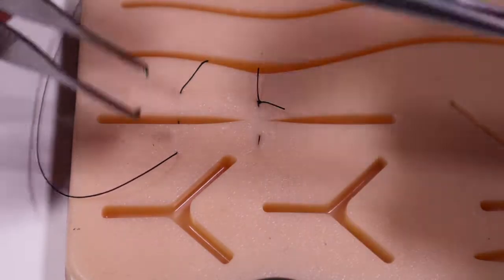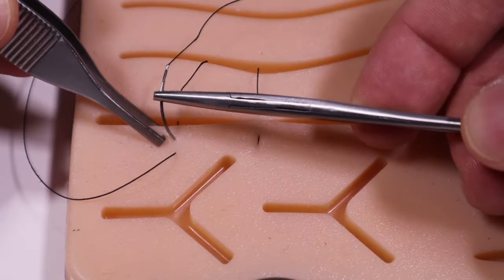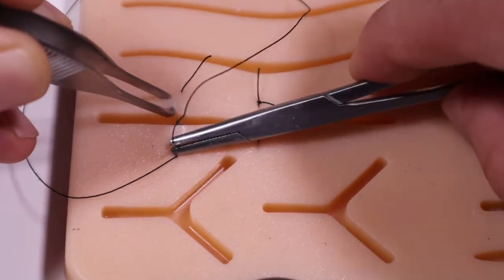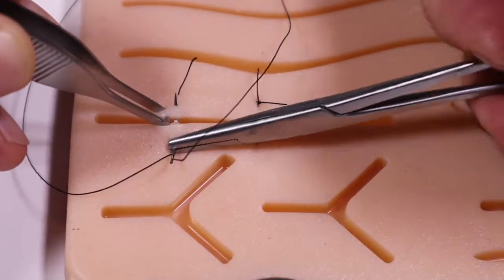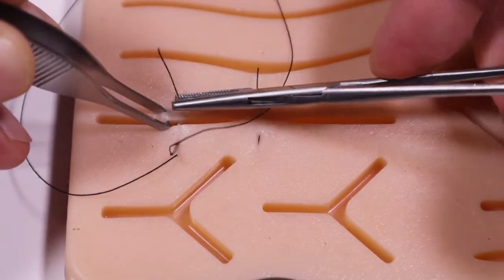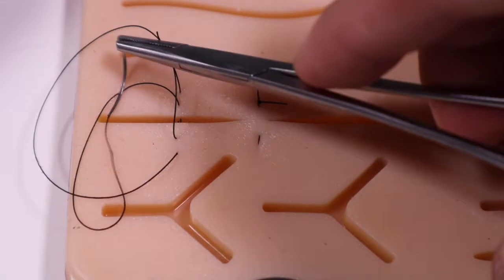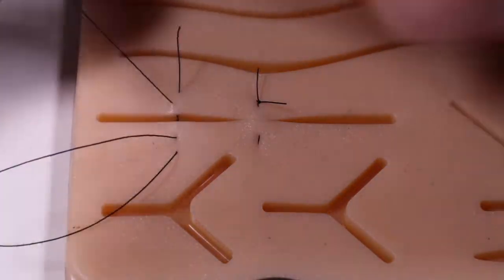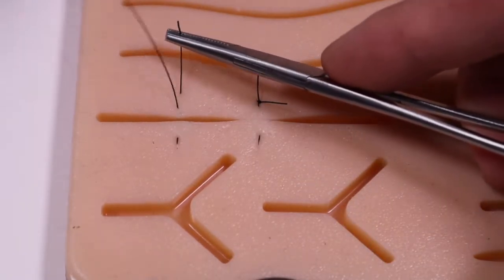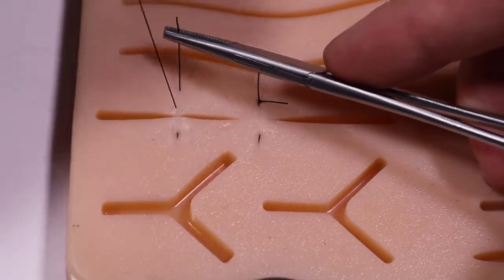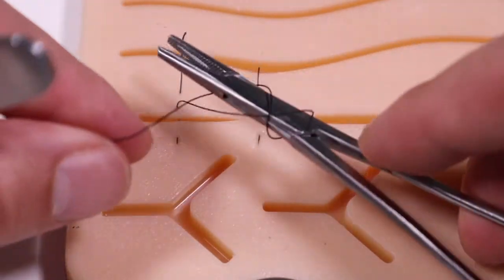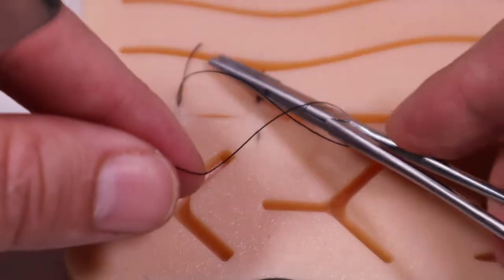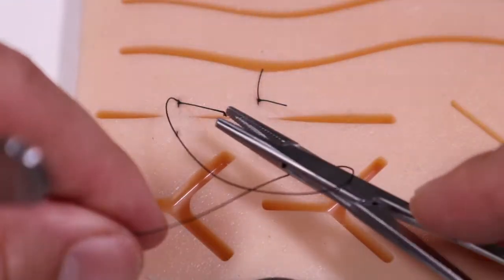We'll reverse load our needle and backhand through. I always hold the end of the suture to make sure I don't pull it through. So two forward throws, tighten it down, cinch it, reverse, and the final forward.